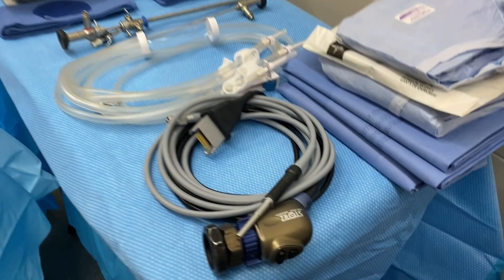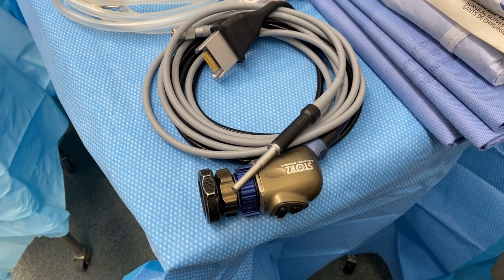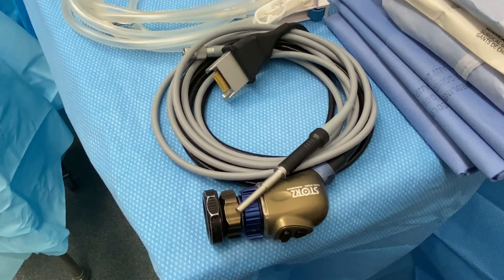Right here we have our camera and light cord.